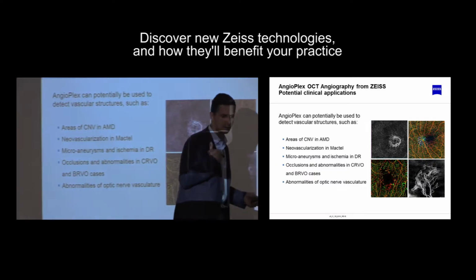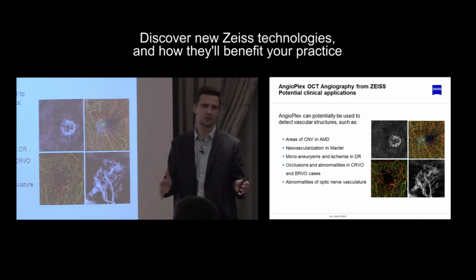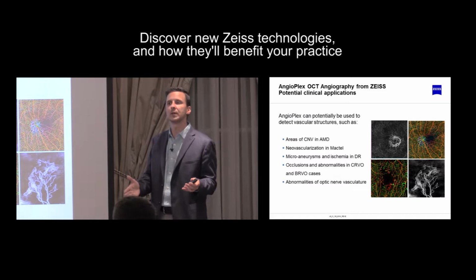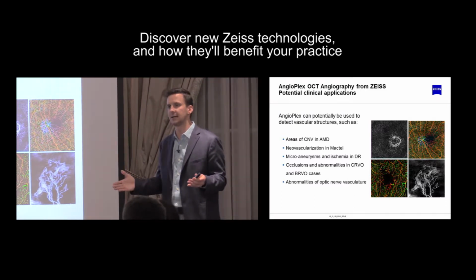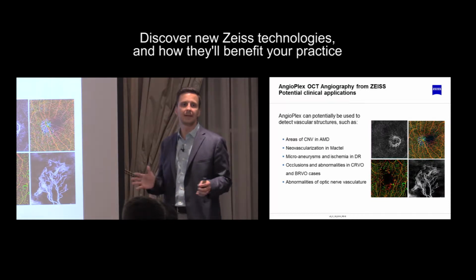And mind you, we do what's called baseline OCT on every single patient that we see that can sit. So every patient that runs through our clinic has OCT done. But in this particular case, we were about 2 weeks into using the new OCTA technology. And 2 weeks into OCTA technology, we had a 50-year-old male that came in for a visit.